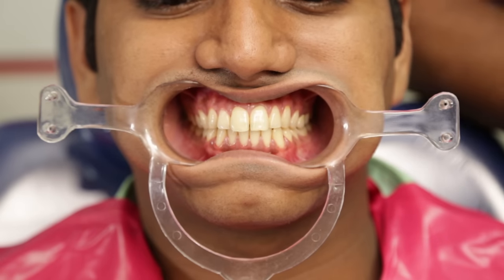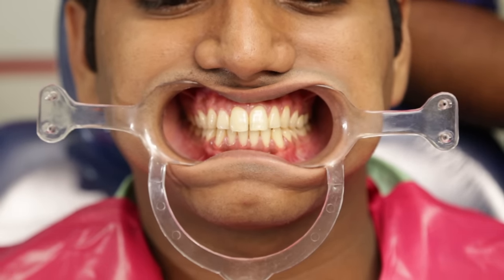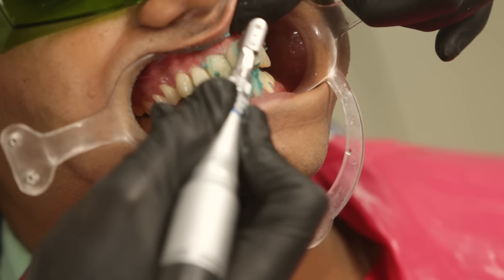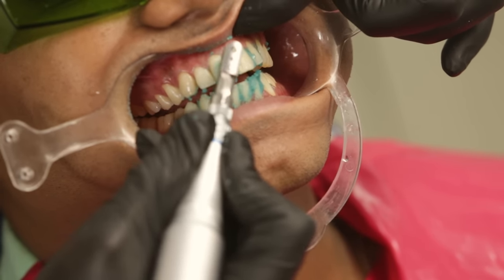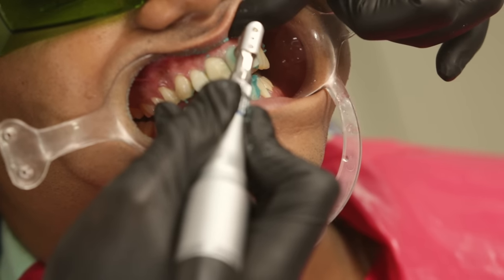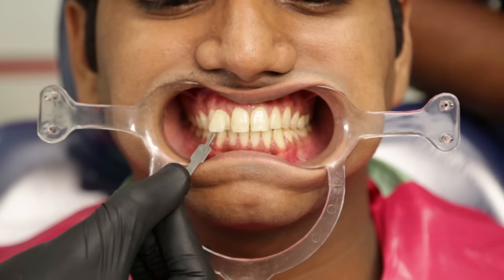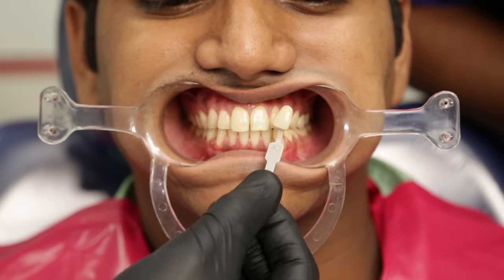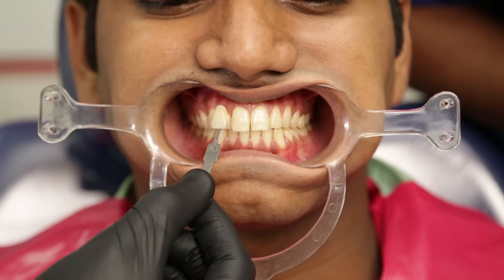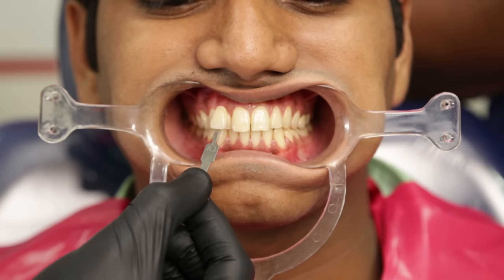This is the case which I am going to demonstrate the bleaching process on, and you can see that I have draped the patient already. I've also completed a scaling in the previous appointment and now I will be polishing the patient's teeth before the bleach is applied. The first step in the bleaching process is to get a rough idea of the patient's shade before the procedure — this will help us evaluate the effectiveness of the bleaching. In this case I can see that the pre-op shade is around B3.